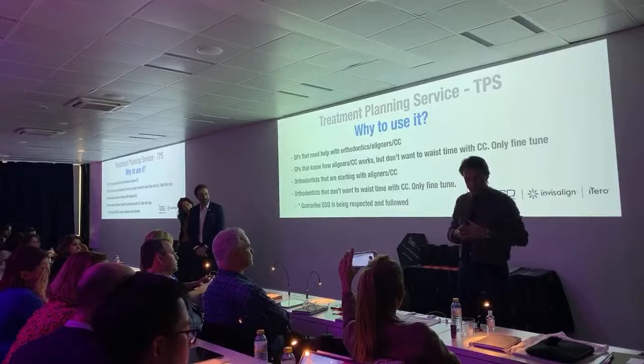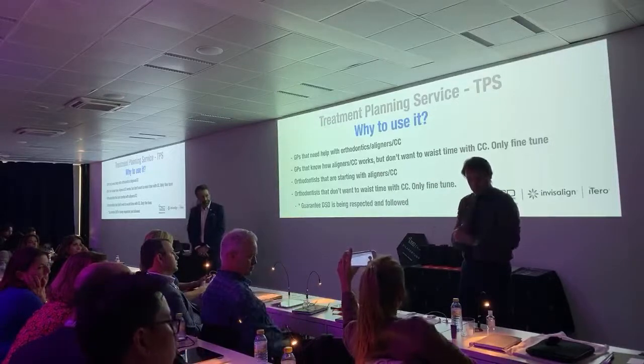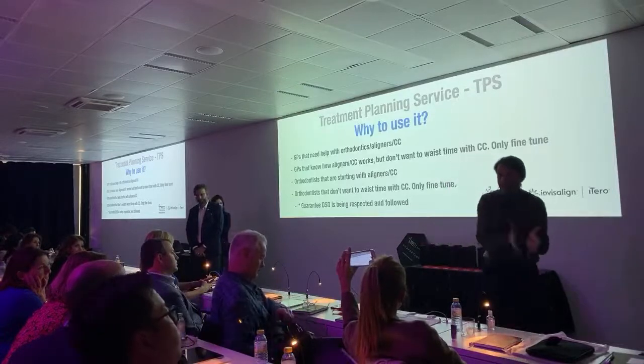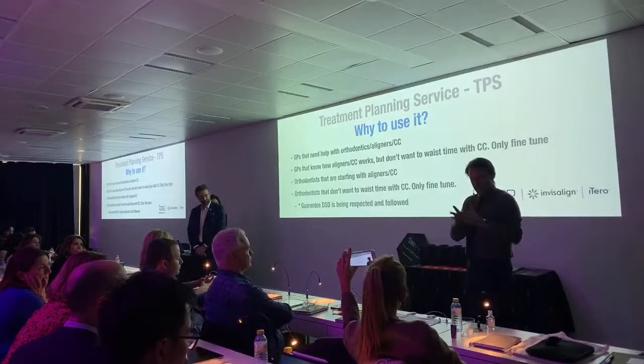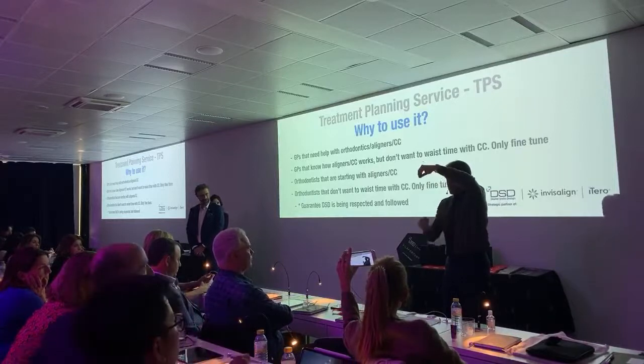You define the plan and you present the plan to your patient. You need to sell the case. There's no Invisalign at that moment. You're not going to order and pay for Invisalign before your patient buys the treatment. So first you need to diagnose, plan, design, and then you need to sell. So you're at the top, specialists are at the bottom.